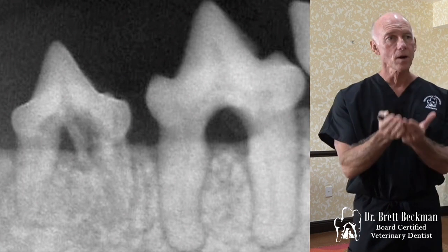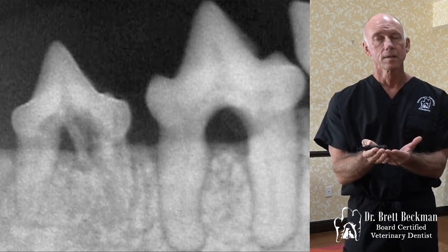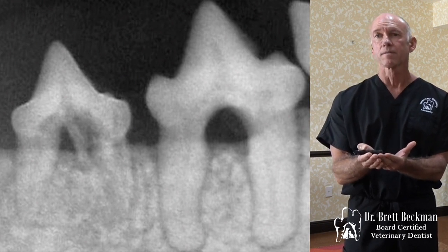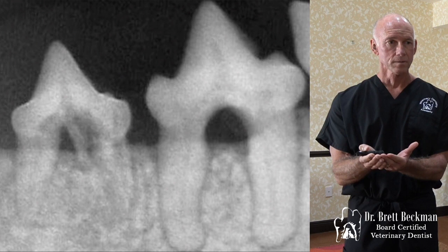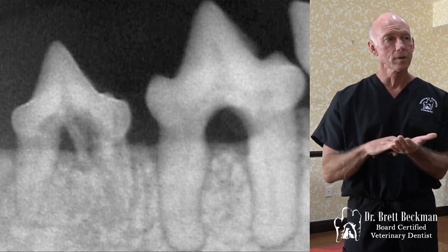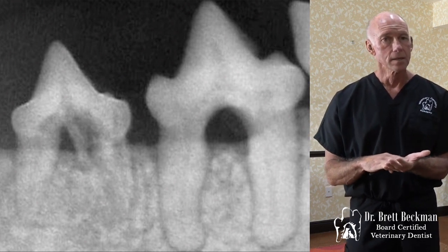But the marginal bone has been compromised, so we've got horizontal bone loss, and consequently we've also got tooth root that's above the marginal bone. So if we do a crown amputation, all of that tooth root above the bone stays, right? By definition.